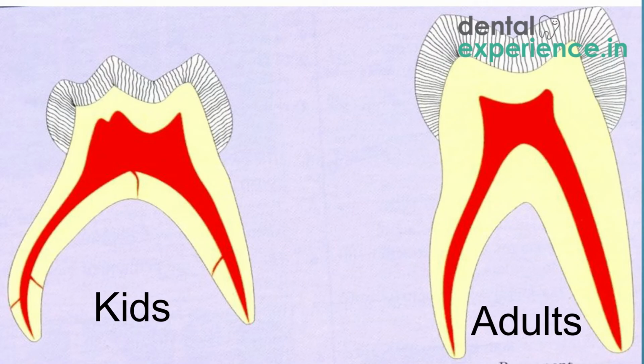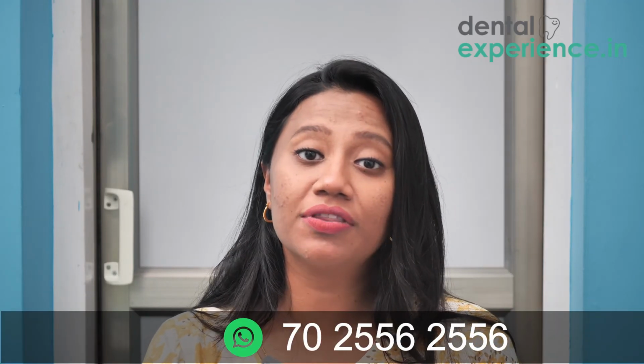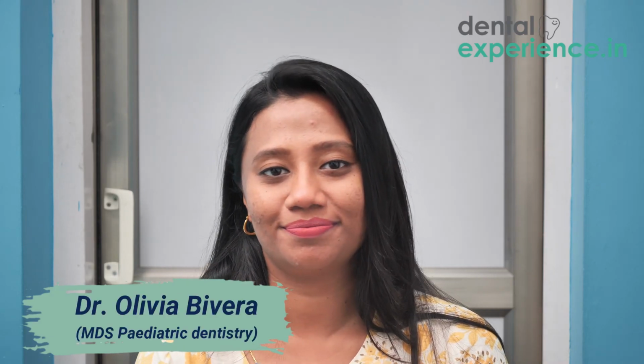Pulpectomies are usually specific to kids' teeth because the roots in children's baby teeth are different from those of adults. A pulpectomy is very important to relieve the pain associated with any kind of infection or dental trauma. Thus, it can also prevent complete extraction of a normal tooth.